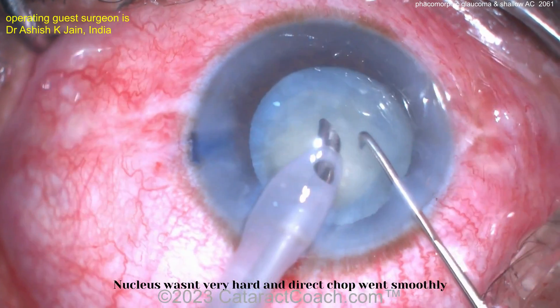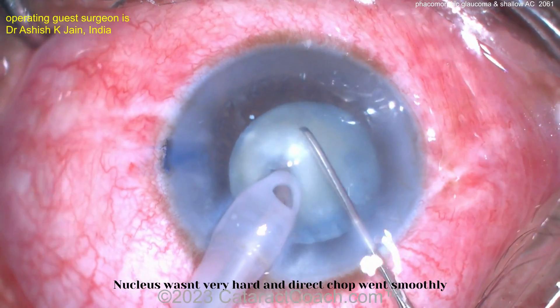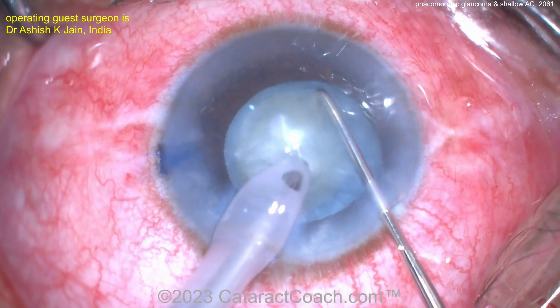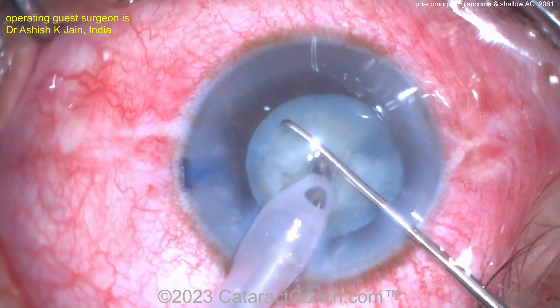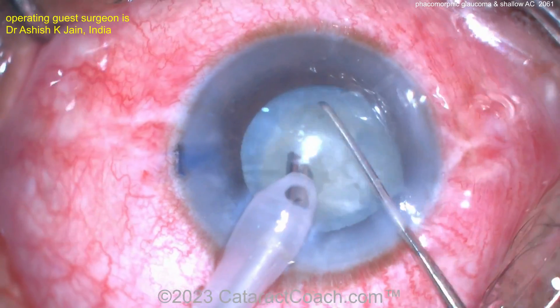Now trying to remove the nucleus — looks like we're going to chop it. Vacuum into the probe, here's the chopper. Not too dense of a nucleus, which is great; that's going to make life a lot easier. It's a little bit of a small rhexis, so don't try to prolapse the nucleus out of the bag. Nice, good chops here.